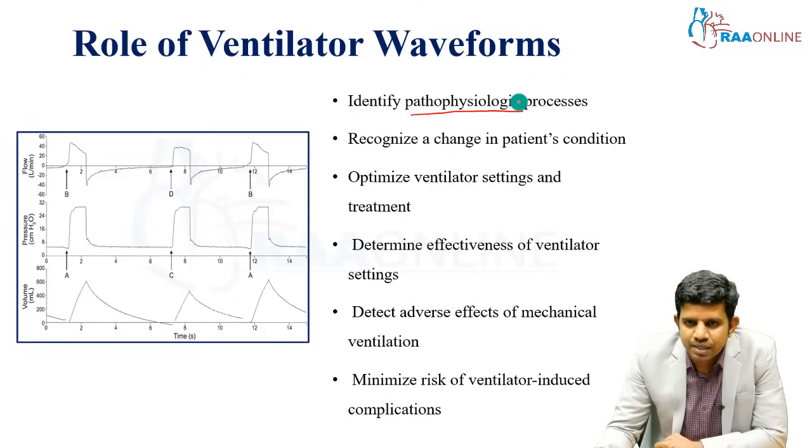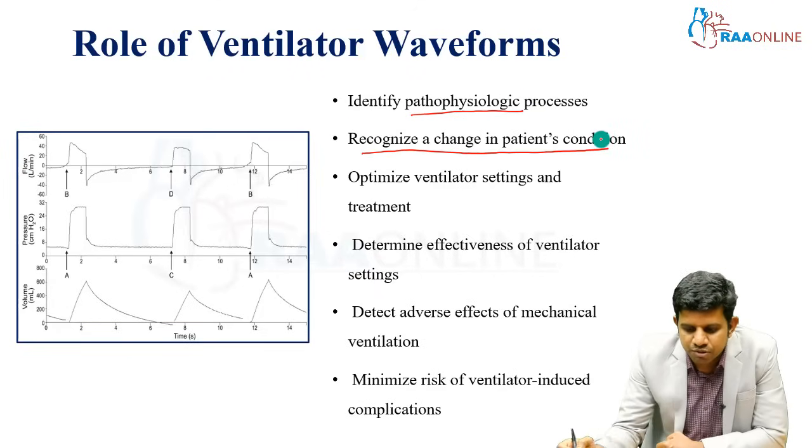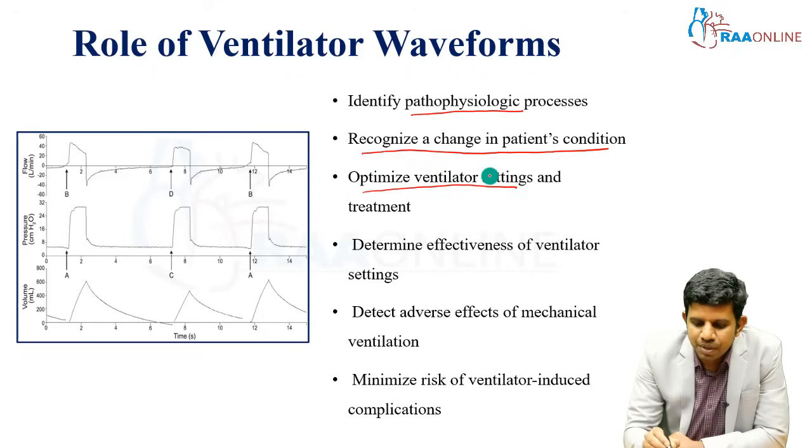Second thing, recognize the change in the patient condition. Patients in ICUs are very dynamic in nature. For example, compliance may be normal in the morning and may worsen during the ICU stay in the afternoon, with pulmonary edema or simple aspiration. We can recognize the change in the patient condition from these ventilatory waveforms. From the change in the condition or pathophysiological process, we can optimize our ventilatory settings, and maybe modify the treatment also.